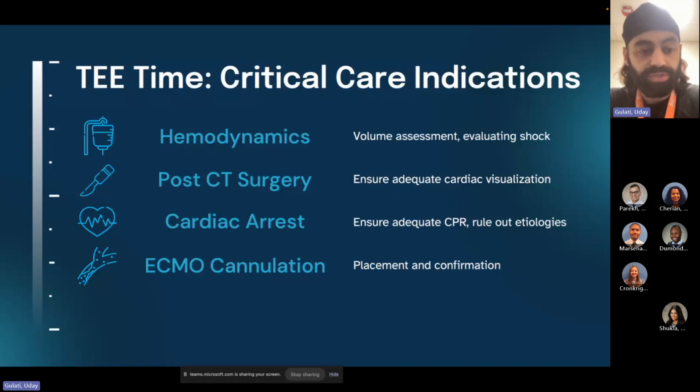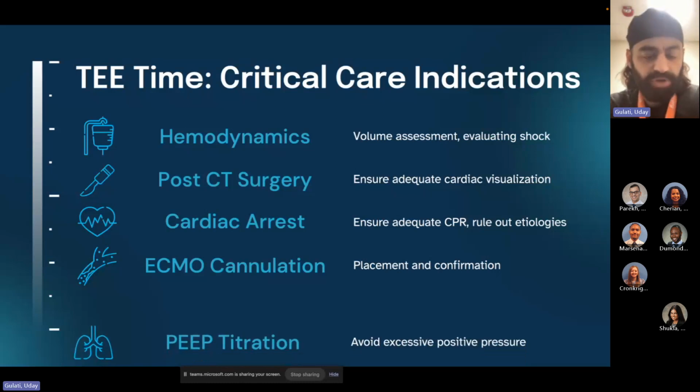And even amongst providers, because the overall maneuverability of a transesophageal probe is a lot more effective, a lot more controlled than the maneuverability of a transthoracic echo, because when we go into probe dynamics or probe knobology, you'll see that there's a lot more control over using a TE probe than a handheld ultrasound probe on the chest. And then, it's not just about volume assessment.